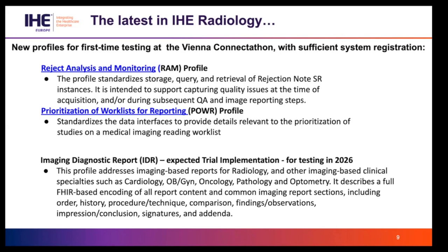The other profile is prioritization of work lists for reporting. Yet another one dealing with the reporting workflow that standardizes the communication of details relevant to the prioritization of studies on the medical imaging reading work list.